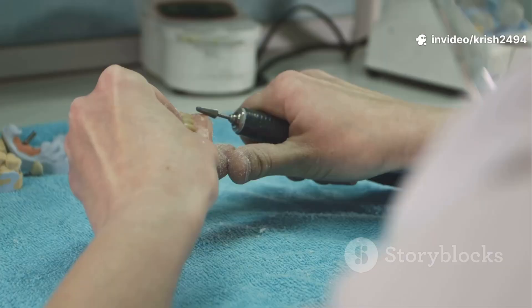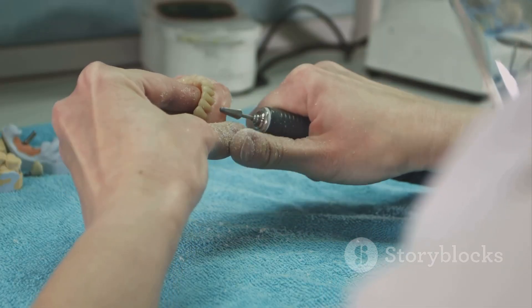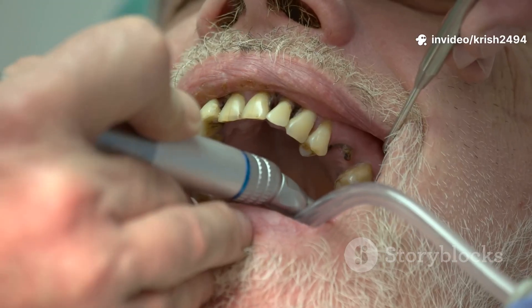After curing, it's de-flasking and finishing. The lab cracks open the flask, removes the stone, and retrieves your denture. They trim off any excess, smooth the edges, and polish everything to a shine.